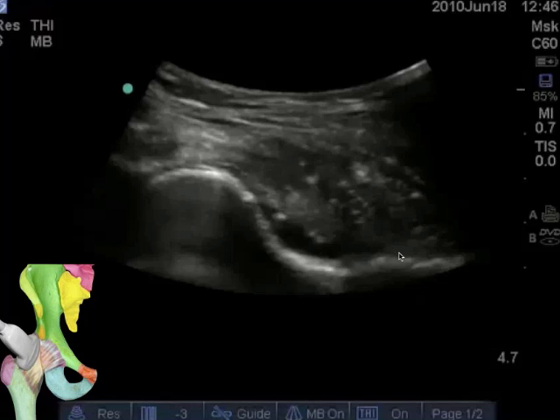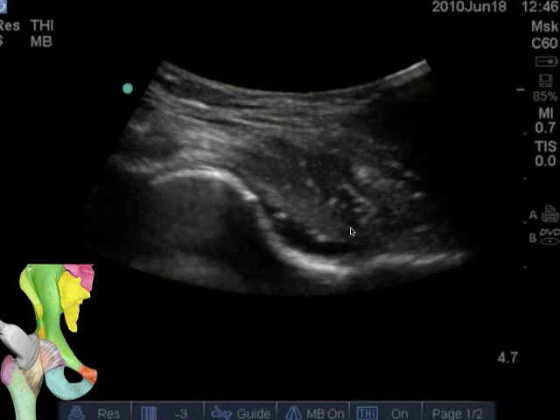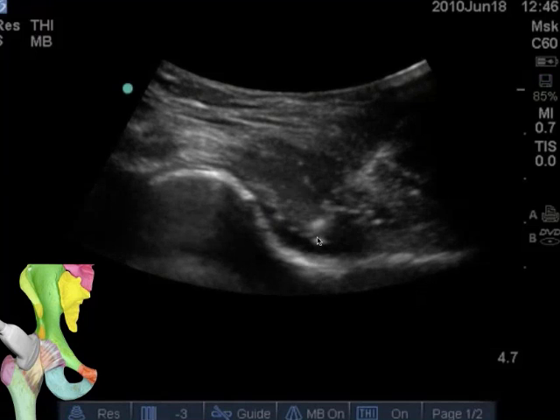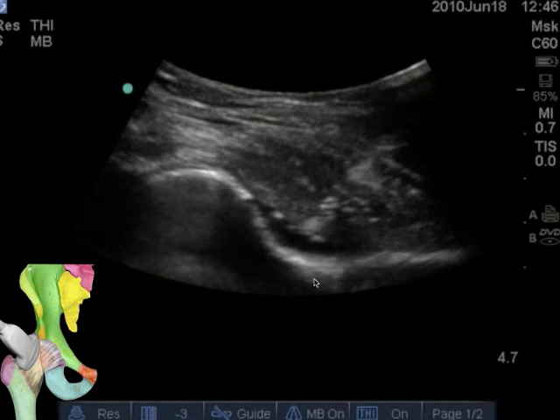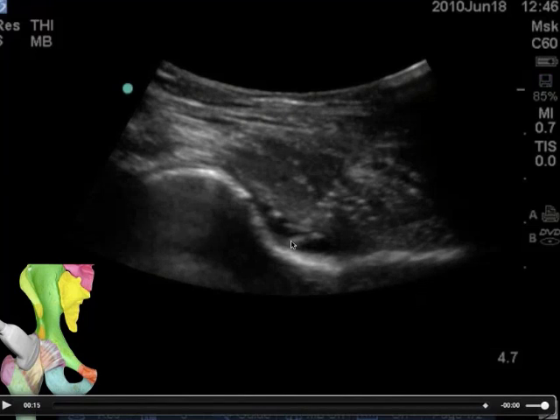This is a video of an actual hip joint injection, and you will see the needle traversing this tissue and the tip ending up here. Here's the tip of the needle. As you see, it's coming in. It is now here at the capsule. He's trying to pop through the capsule. He's not through yet. Pop. He got through the capsule, and there's the tip of the needle. There is no question at this point that you are intra-articular. You are deep to the iliofemoral ligament and joint capsule. Here's the shaft of the needle. There's the tip of the needle.